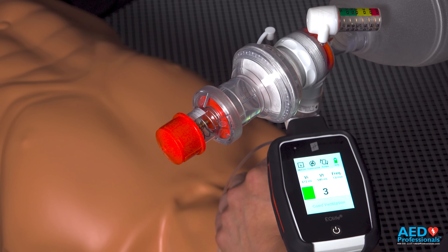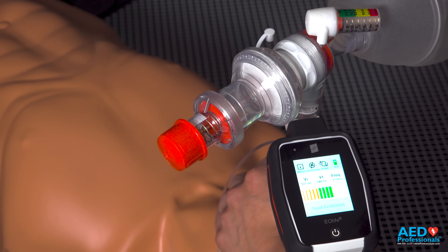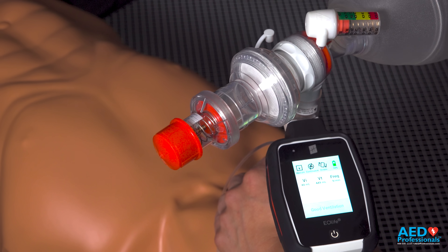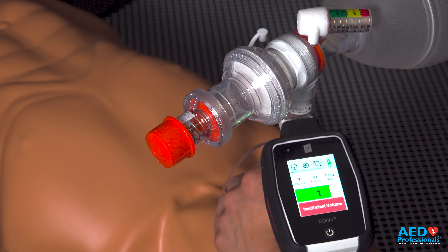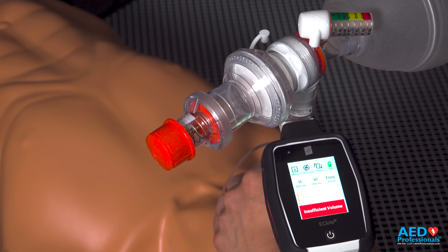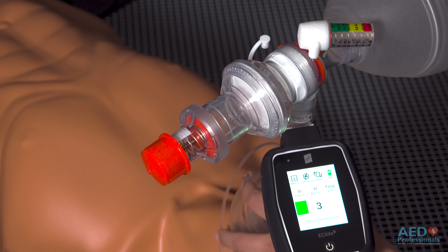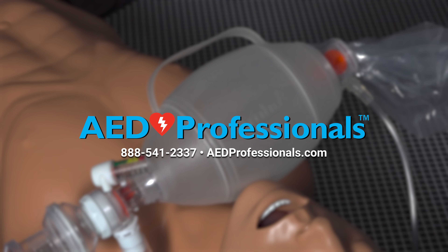Excessive volume — I'm blowing too much air into this patient right now, so let's slow down. Insufficient volume — not putting enough into the patient. And there we have it, and there's another one. This is a pretty good example.